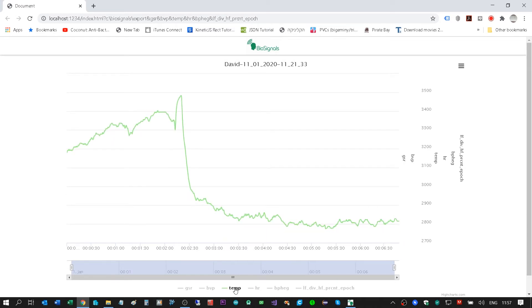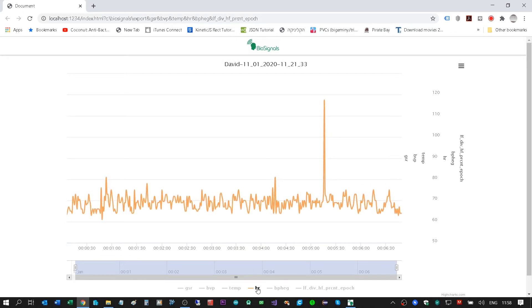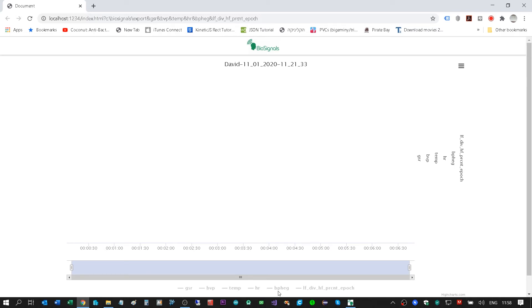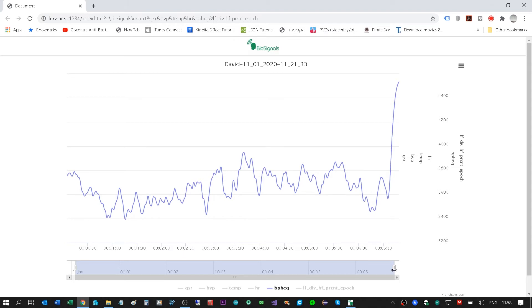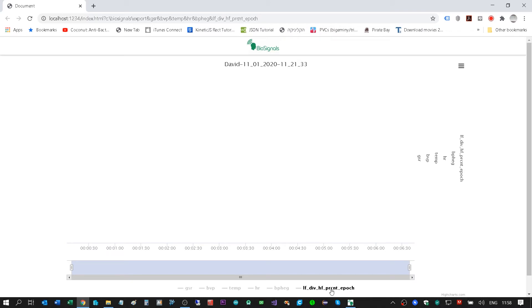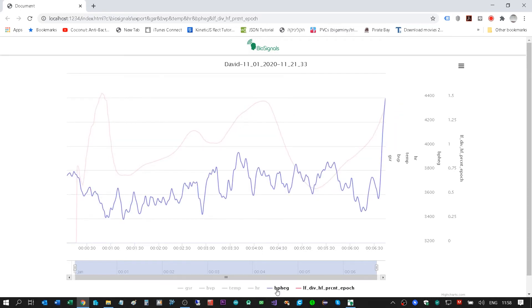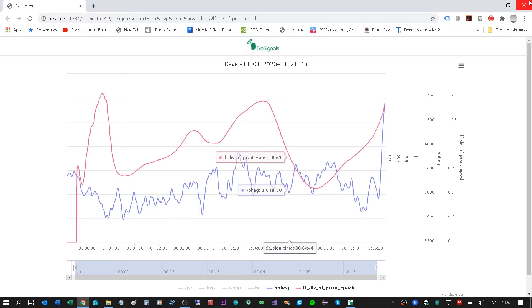Zooming in, you can see it is made of a lot of heart waves — blood volume pulse waves. I can also check the temperature signal, the heart rate, and the heart rate numbers as real heartbeats per second. Then blood pressure during the training. Next is LF/HF percentage epoch — low frequency divided by high frequency percentage power — with an epoch of 120 seconds. This is the HRV analysis. As higher as it is, it means better training.